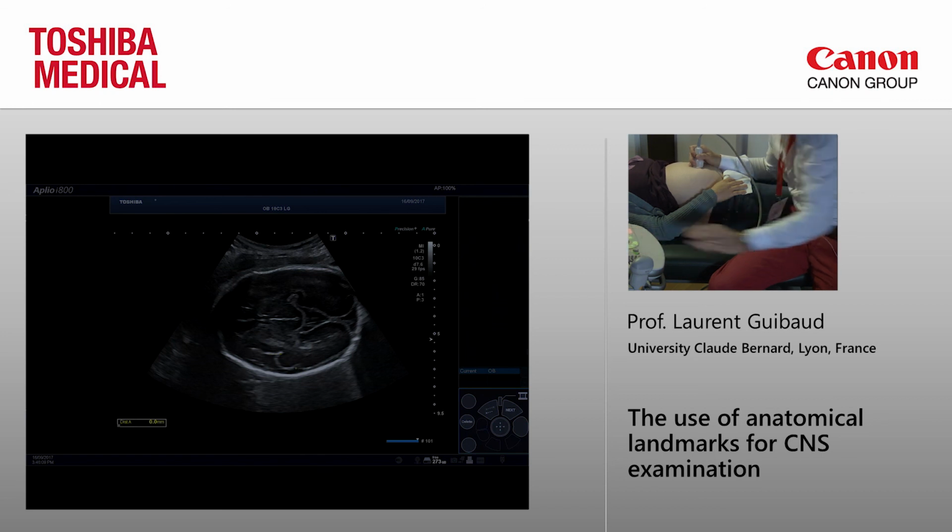The small depression appears around 27, and she's between 26 and 27. So you see, you don't need to be too precise, but if it fits within 1 week or one and a half, it will be perfect. When there is a delay of 2 weeks, I begin to be concerned about cortical disorders or delay of the maturation.